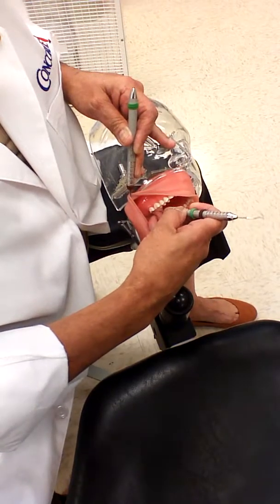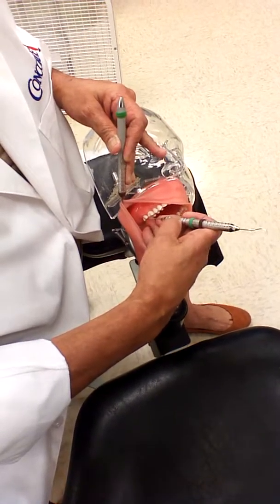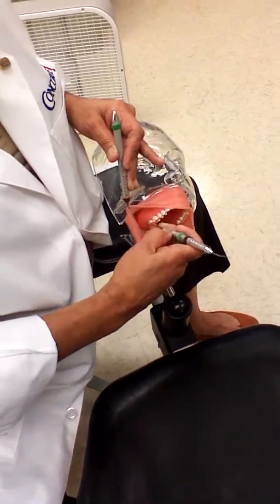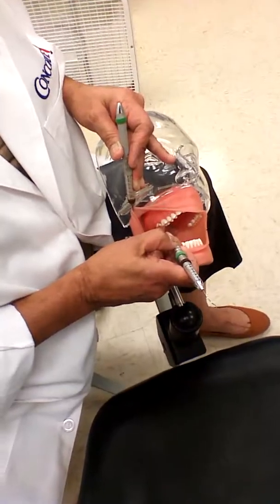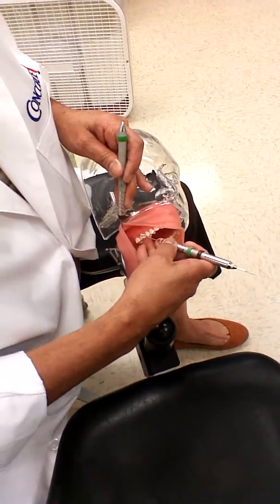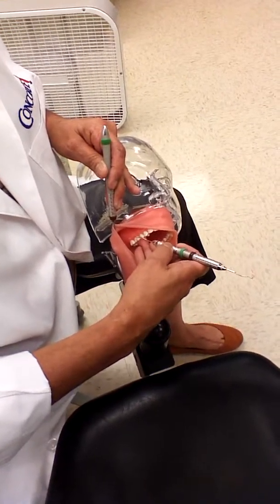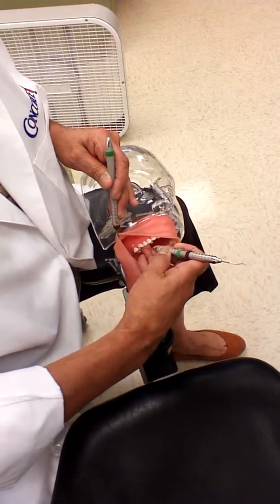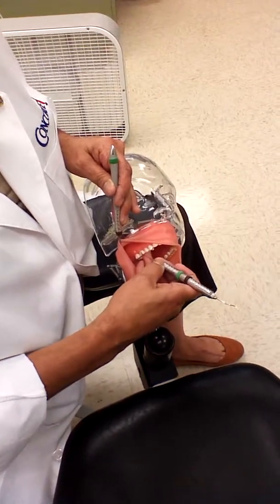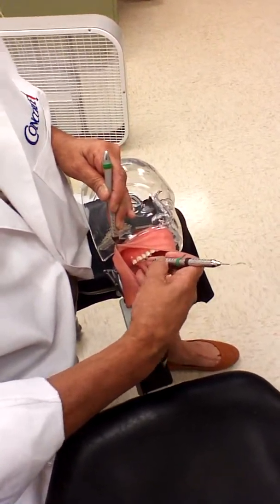Now those of you that have shorter fingers, you know, it's a little bit of a challenge. And then later on, when we start learning extraoral fulcrums, then that'll be, oh, sorry, these teeth are slick. So I want to pivot my way around here. And that's a little bit closer than I really like to be. But if I were doing this in real life, I would be fulcrum down in here. And try to keep my fingers a little bit more together.